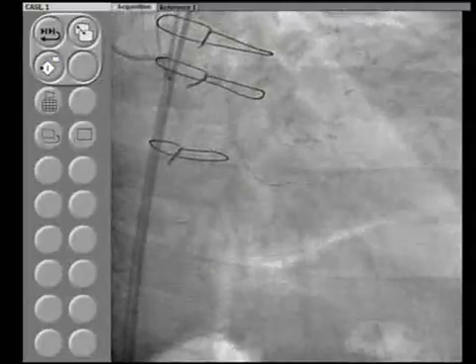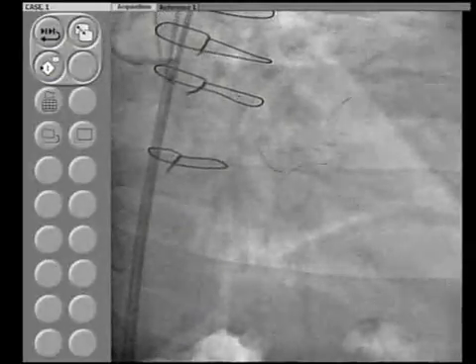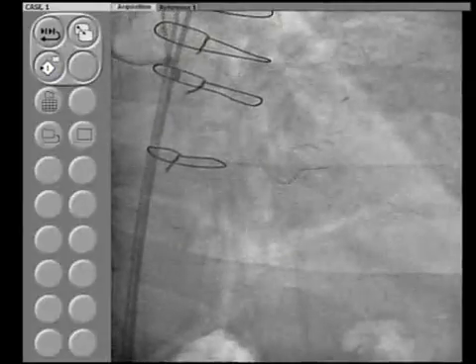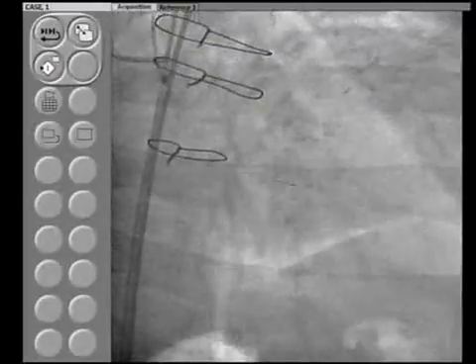I think you're in the lumen now. Good. Now it looks like so far we have gone to the central lumen. Yeah, but it's tough because I am having a tough time advancing the wire. That tells you that you may not be in the true lumen.